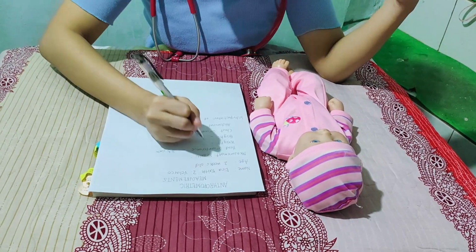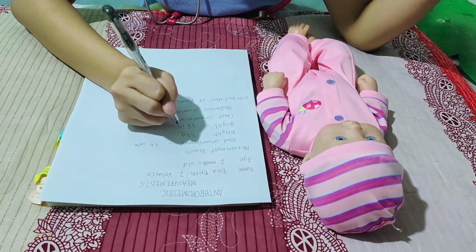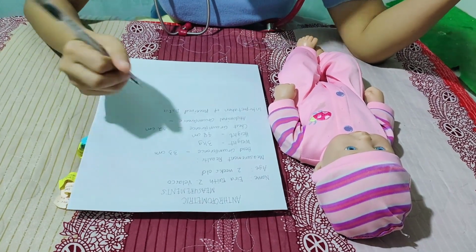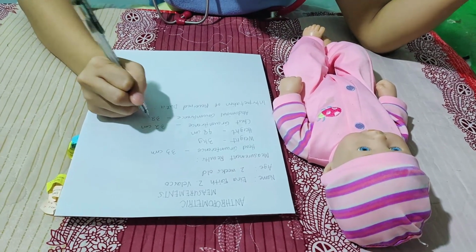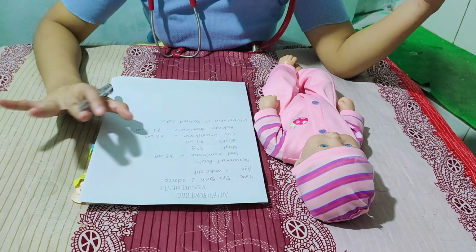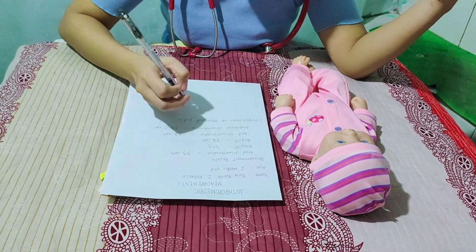For the weight, we have 3 kilograms. For the height, we have 48 centimeters. For the chest circumference of the baby, we have 32 centimeters. And for the abdominal circumference, we have 32.5 centimeters. But in some references, the abdominal circumference of the baby is not really recommended, but we still get the data of it.